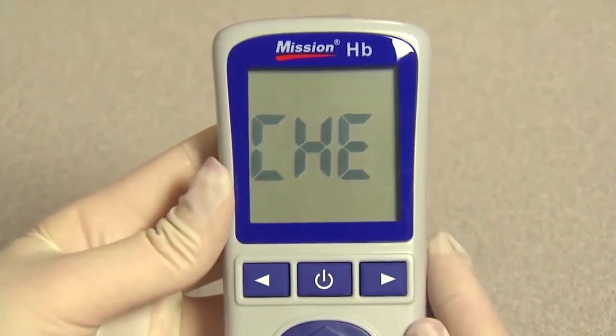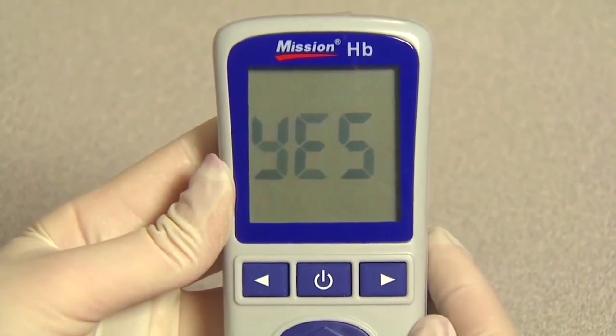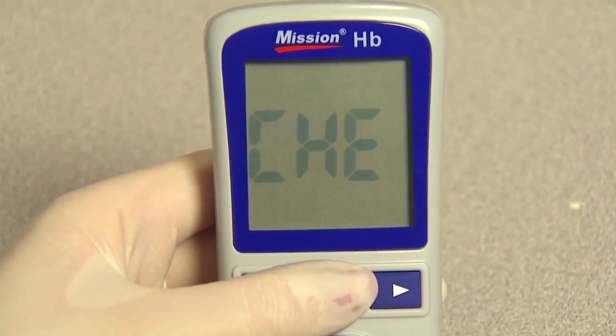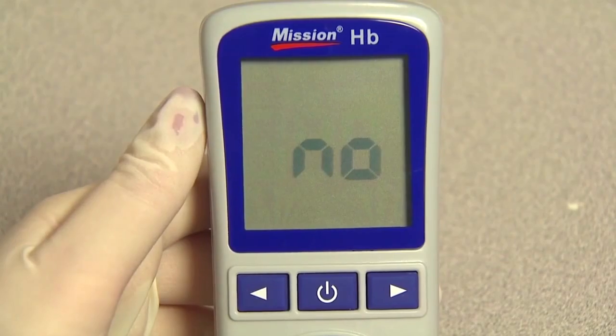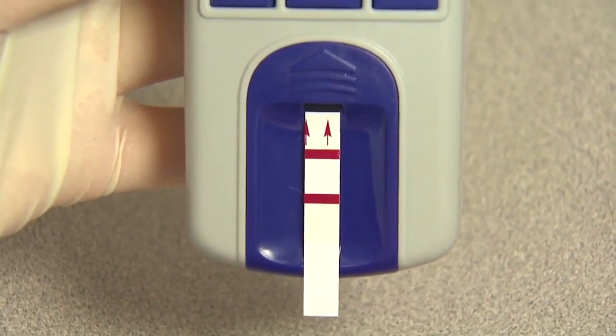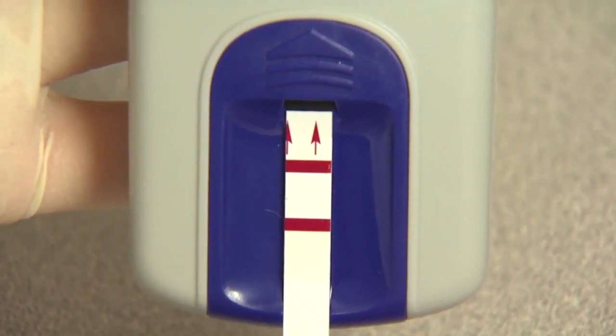Press the power button to start the optical check. If the meter displays yes, the meter is normal. If the meter displays no, the meter is not functioning properly. Check the control strip for contamination or to see if it is damaged. If there are any visible signs of damage or contamination, discard the control strip and retest using a new one.